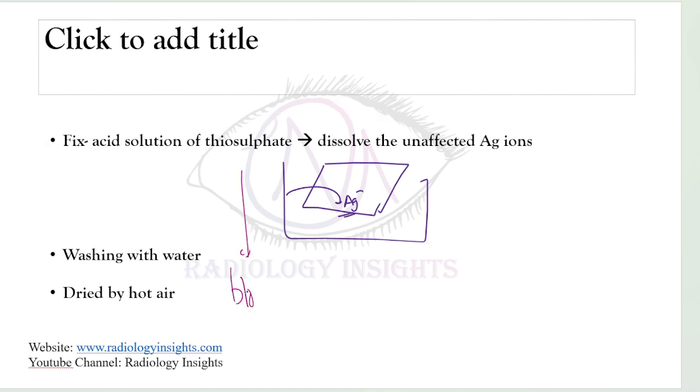So we have to remove all the hypo, or thiosulfate solution, which is provided to the film during fixing. If it is not washed properly and drained, then the film may turn brown or yellow with time, causing the stored films to have a vinegary smell.